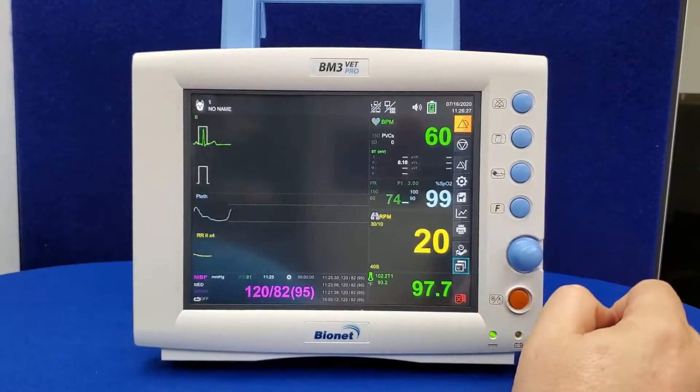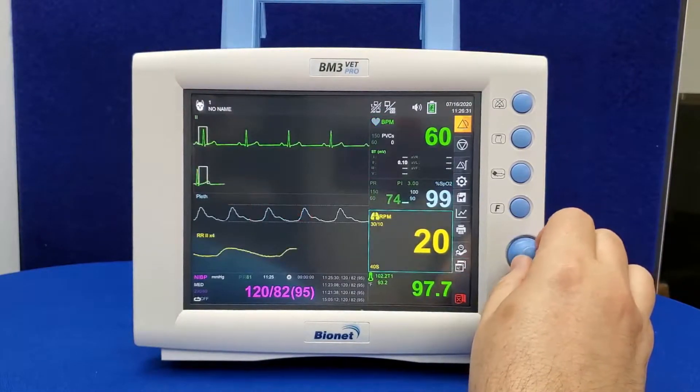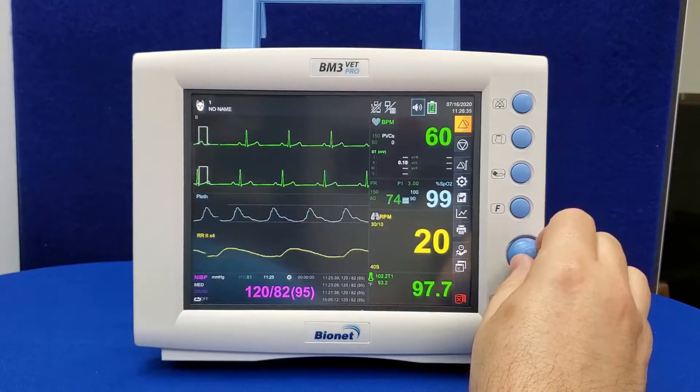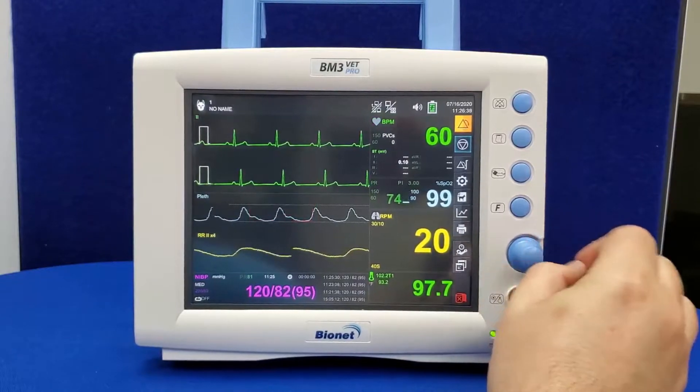The trim knob allows you to utilize the menus and settings without having to use the touch screen. Simply turn the knob until the option you want is highlighted, and click in to select that option. To turn off the monitor, hold the power button for at least three seconds.